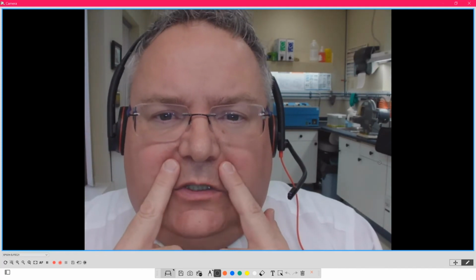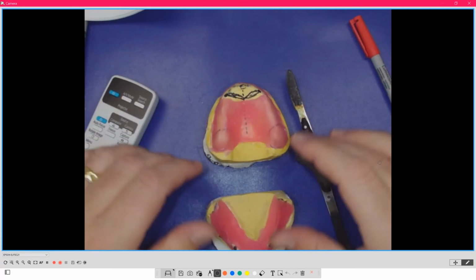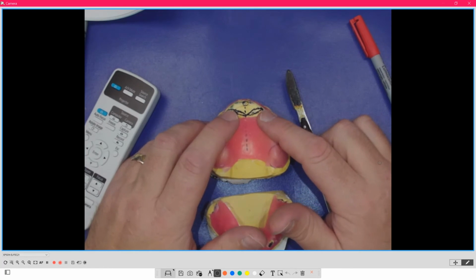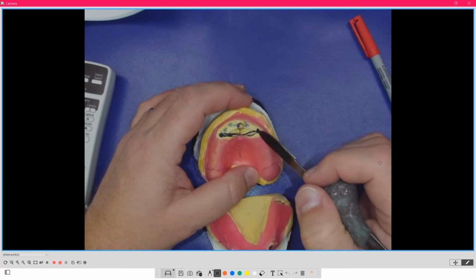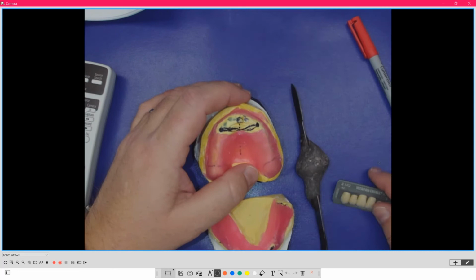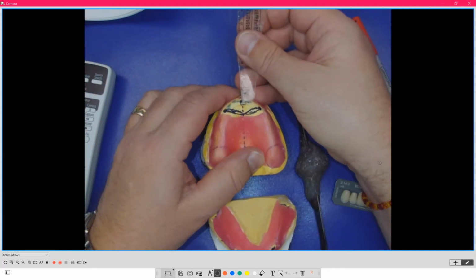By following this model analysis technique, we're making sure that the teeth are coming in at the right position. This is one of the most important model analysis marks that I make, not only the incisive papilla, but the long branch rugae, because that points to me where the cuspids go. Typically, we're going to be setting the anterior teeth 6 to 9 millimeters ahead of the center of the incisive papilla.